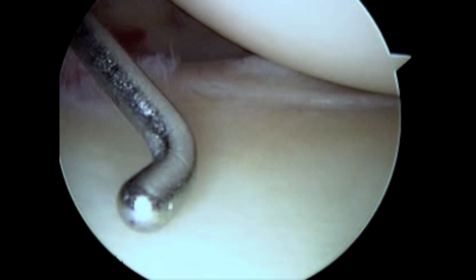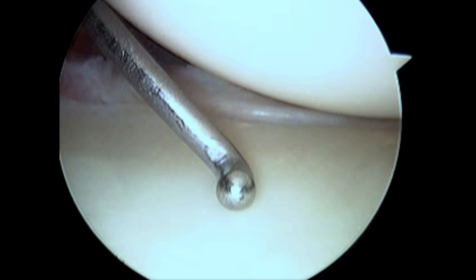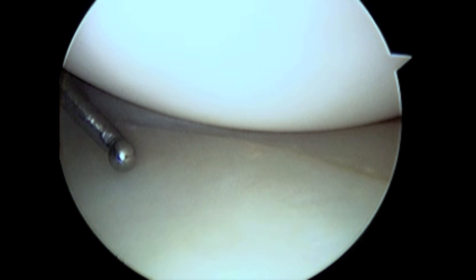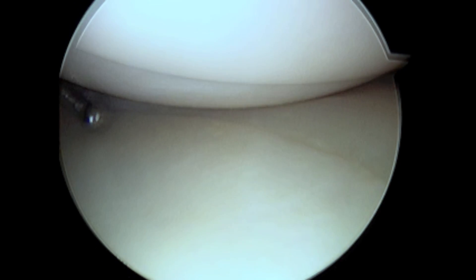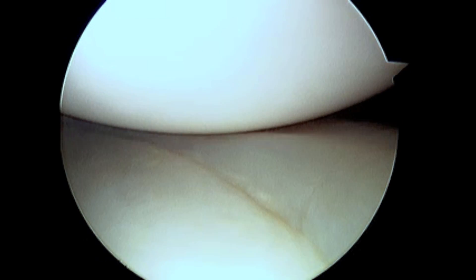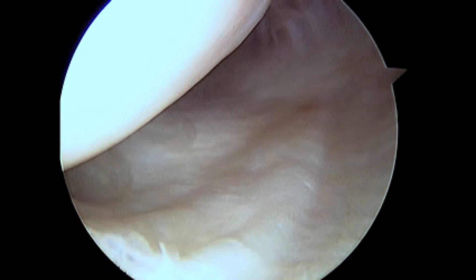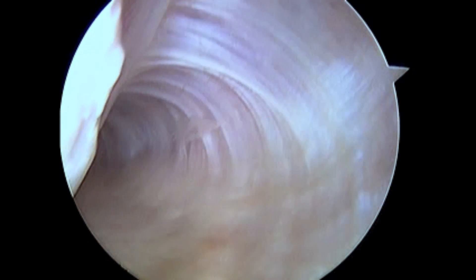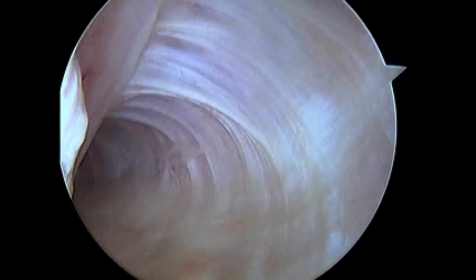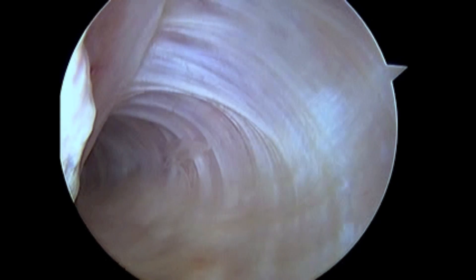As we pan out with the arthroscope, one can visualize the inferior aspect of the glenoid labrum. We then advance the arthroscope into the axillary recess, where you can see the thickening of the inferior capsule forming the posterior bands of the inferior glenohumeral ligament and the capsular attachment to the inferior portion of the surgical neck of the humerus.